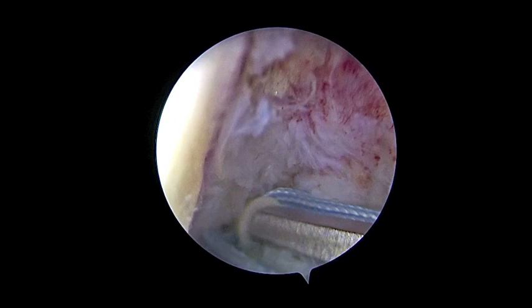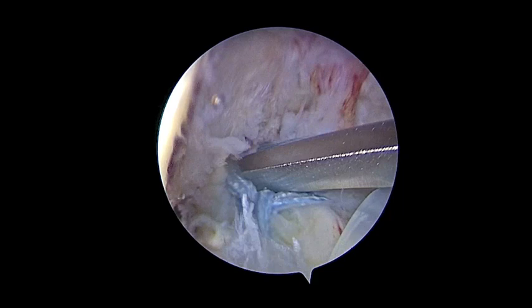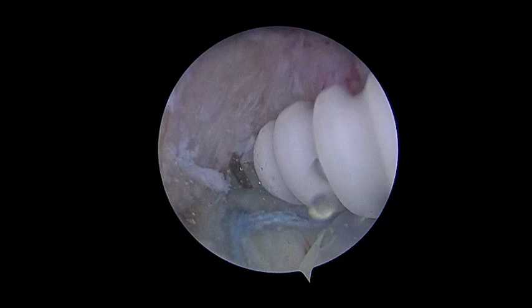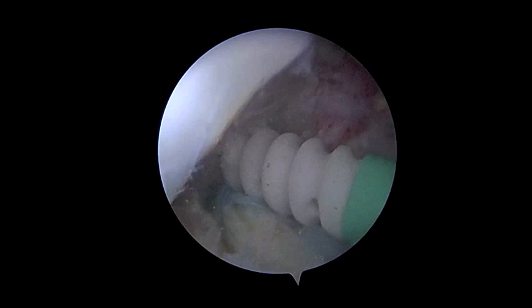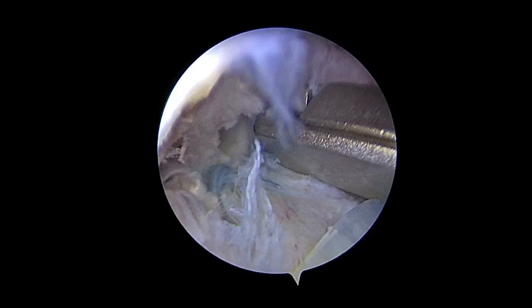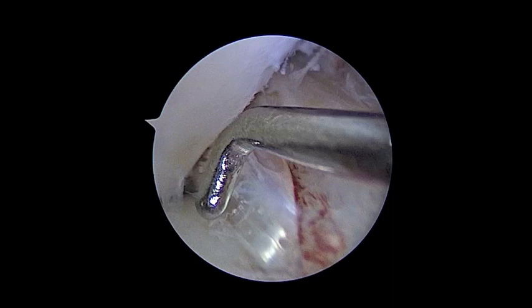We tie the suture — the suture ties the remnant — and we start to gently insert into the hole the SwiveLock 4.5 mm. We start screwing it in, then cut the suture. We probe the graft before final fixation.